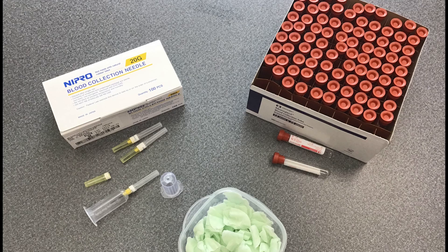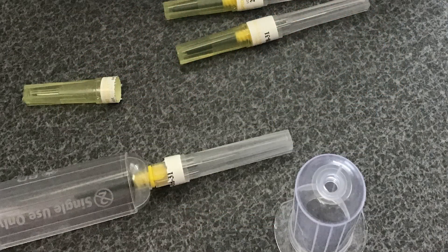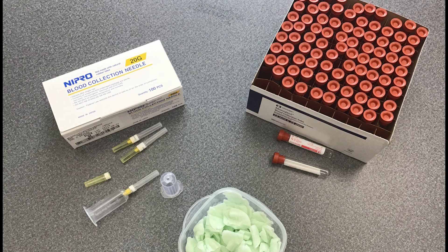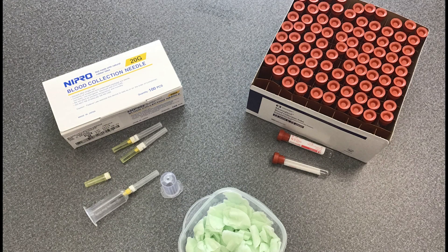To perform a jugular blood draw on a calf, you will need either a 20 gauge needle and syringe, or a blood collection tube with a 20 gauge needle and needle holder. The needle should be an inch in length. In this video we are using a blood collection tube and needle. You may also want alcohol wipes to wet the calf's coat, as this allows for better visualization of the blood vessel.